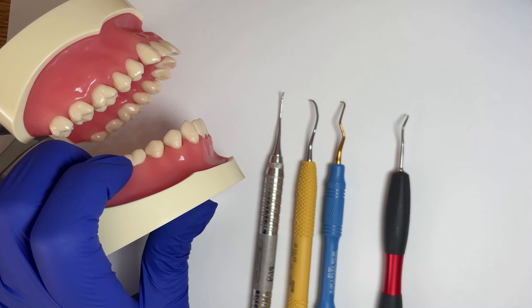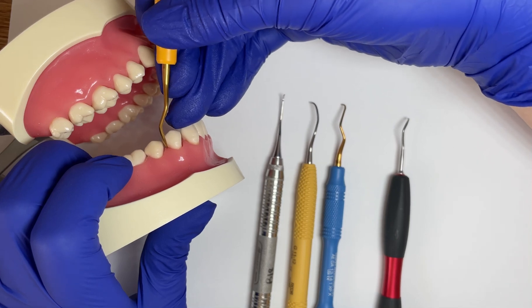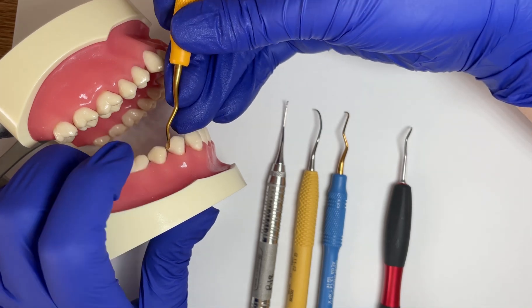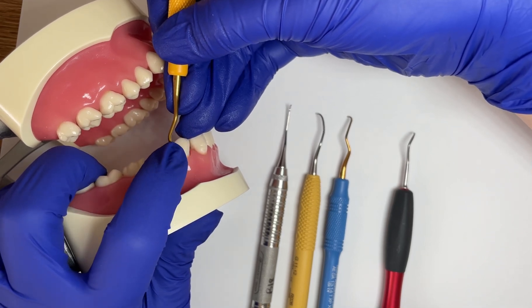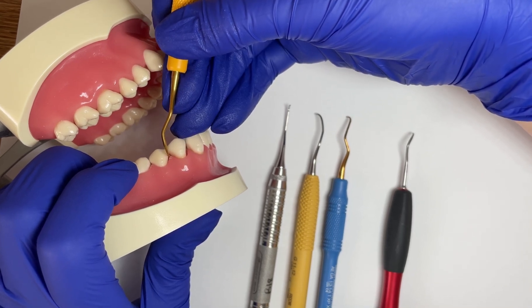With a Gracey instrument — for example, this double Gracey — the tip is already oriented at a 70 to 80 degree angle. So when I use this instrument, I want my terminal shank to be parallel to the long axis of the tooth when I'm instrumenting. We use this lower terminal shank quite a bit to determine where and how we work on a tooth properly.